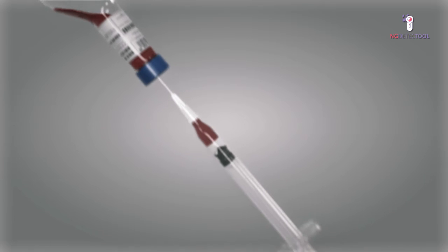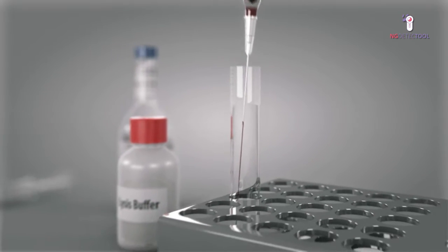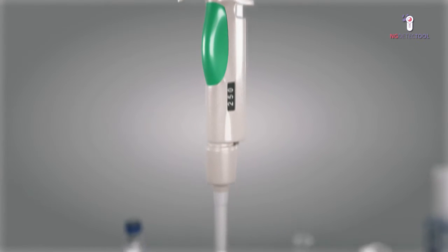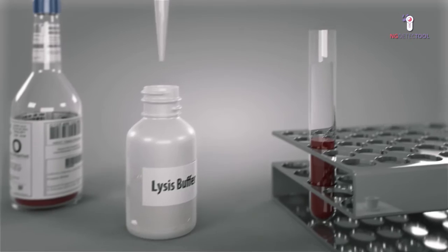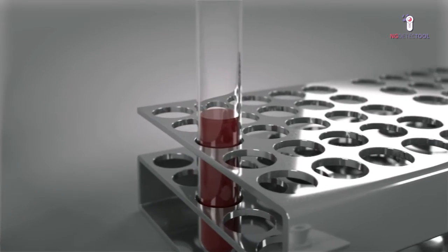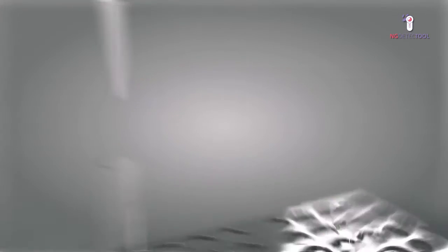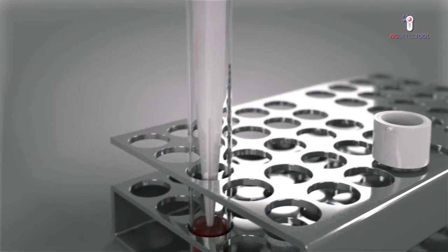When working with a positive blood culture, the first step consists of mixing 500 microliters of the sample with 250 microliters of lysis buffer and letting it react for a minimum of 2 minutes and a maximum of 30 minutes. Then insert the cup into the lower part of the device and load 500 microliters of this lysate into the cup.